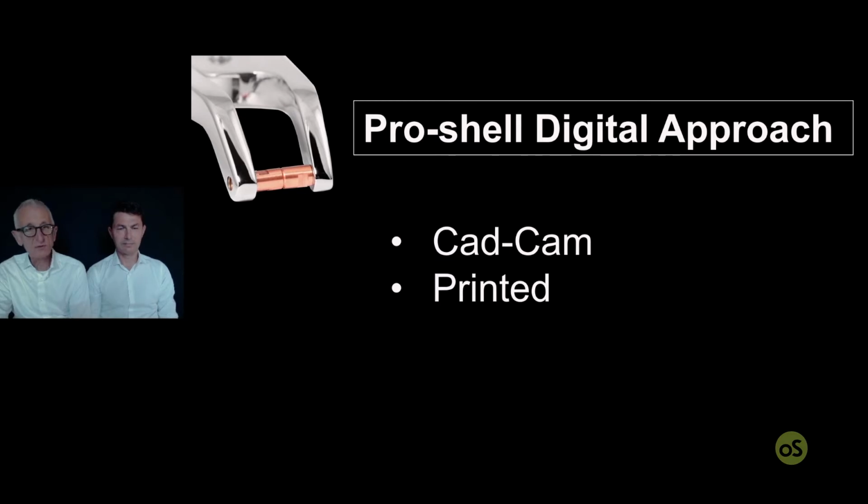So we have together with us once again our lab technician Gianluca Siginolfi, and I will make a short introduction and then I will let Gianluca go on. So we can make digital shell by means of some CAD/CAM procedure, or today also more and more with 3D printing.